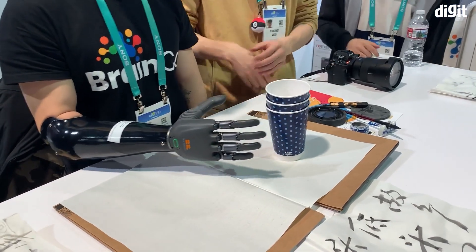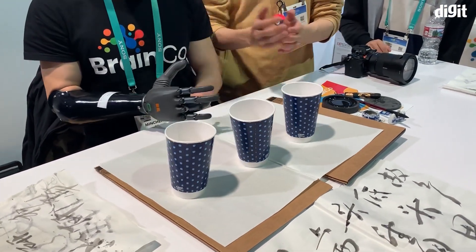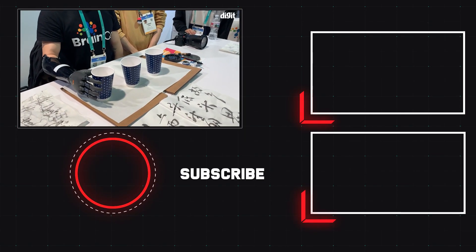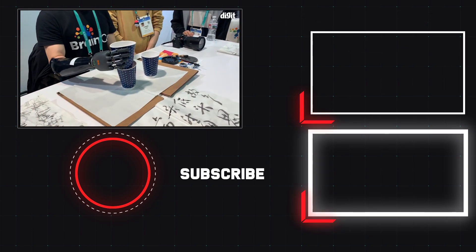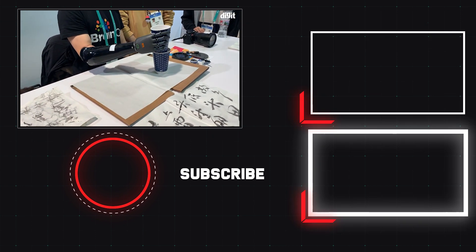This is absolutely brilliant and a great innovation for medical technology. So there you have it guys — that was a quick look at BrainCo's prosthetic forearm for people who have lost their forearm. Thank you so much for tuning in, and for more from the world of technology, stay tuned to Digit.in.